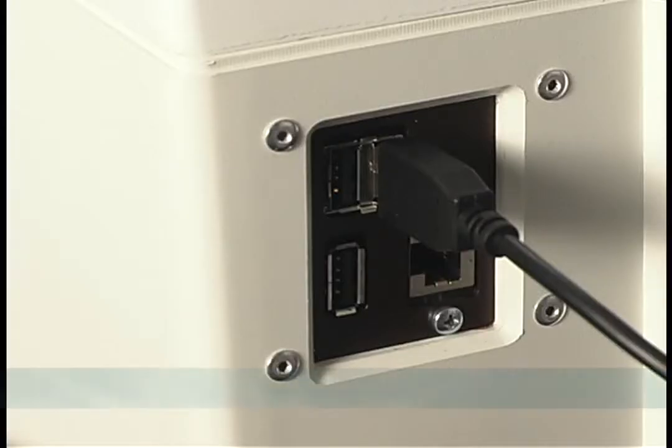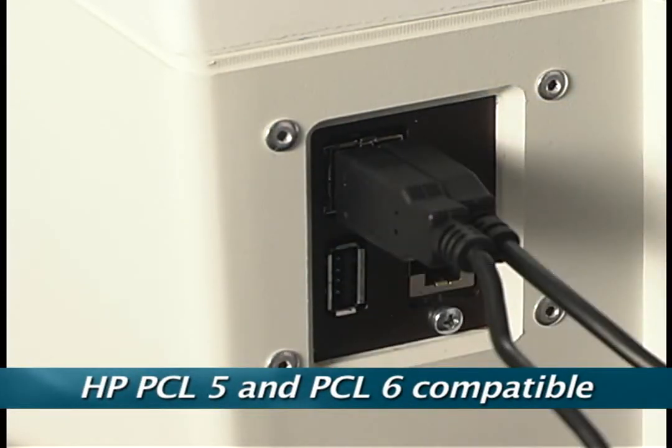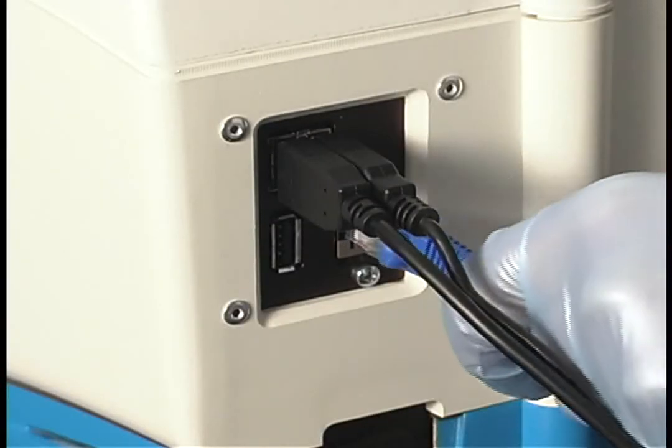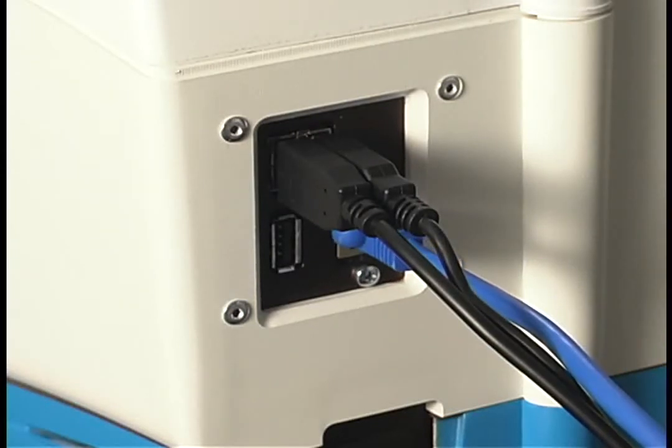If you'd like to print your results to an external printer, please connect your printer now. USB printers that comply to HP PCL5 or PCL6 standards have been tested and found to be compatible with the STAR. You'll also find an Ethernet connection port on the back of your instrument, and should you wish to connect your STAR to the Internet for remote diagnostics and other features, you may do so at this time.